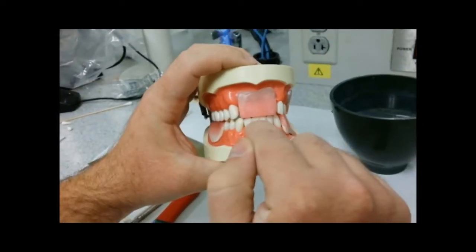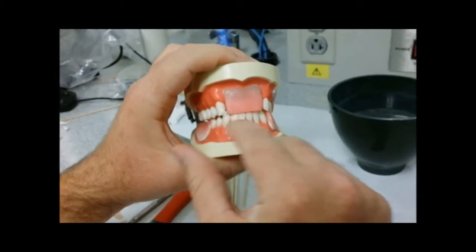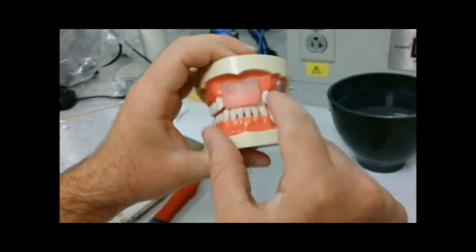See the wax is hitting the teeth, wax is hitting wax and so what this means is this is not an accurate registration of your patient's actual bite.